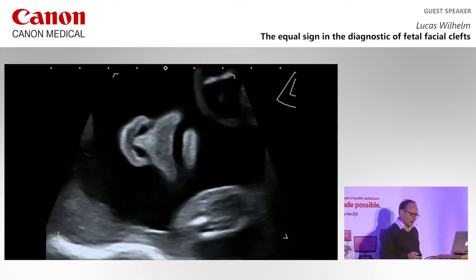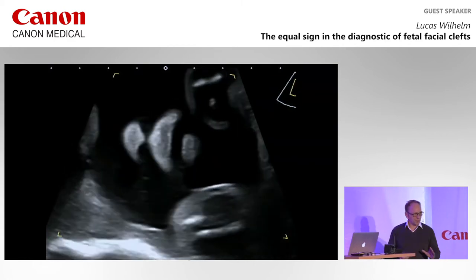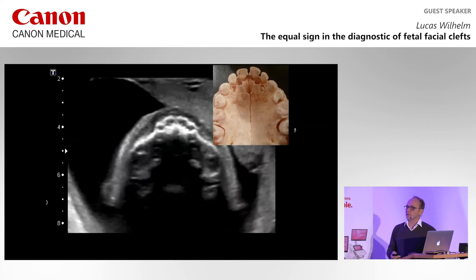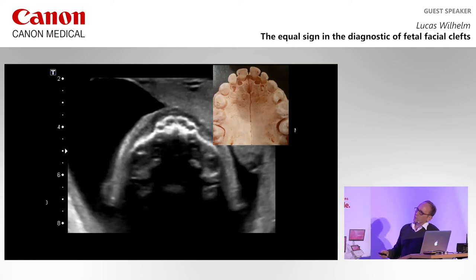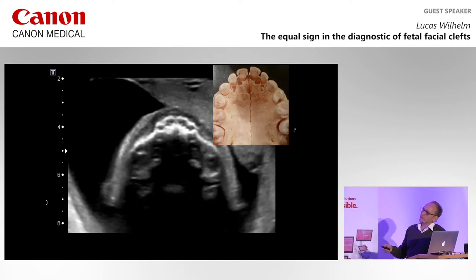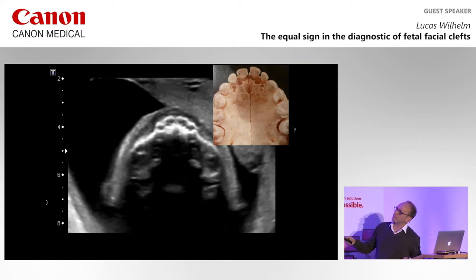When you find a cleft lip, the next step has to be the assessment of the alveolus. For this, you have to get an axial plane — you see here the alveolar ridge with the alveolar cavities. Inside the foramen, you see the fusion lines between the incisors and the canine teeth. This whole segment with the median part of the lip and the incisors is called the pre-maxilla, which is the primary palate. The incisor foramen is the border between the primary and the secondary palate.